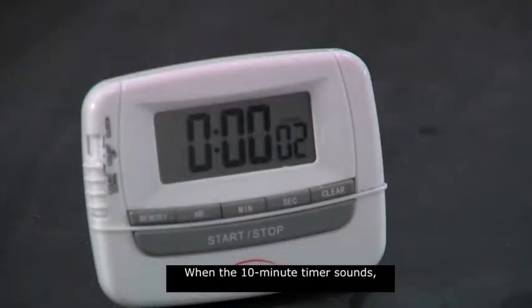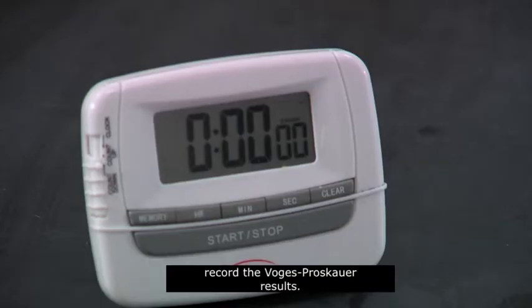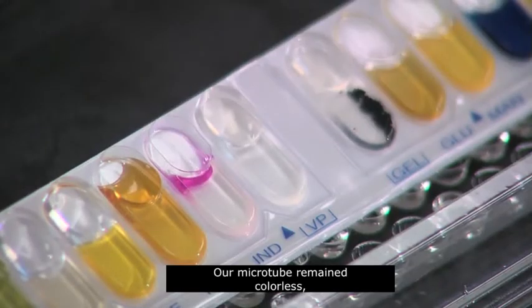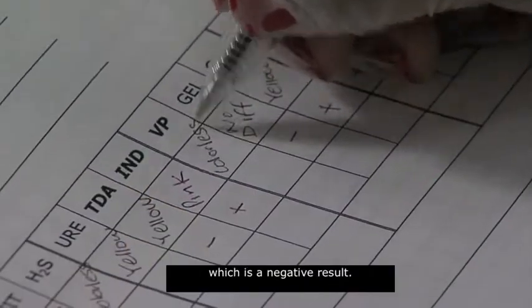When the 10-minute timer sounds, record the Vogue-Proskauer results. Our microtube remained colorless, which is a negative result.